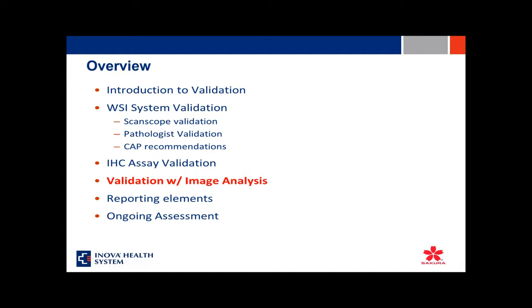And again, there are some other controls also that we need to test every day for these systems. These controls must be tested each day on patient sample testing, and you have to have more than one level. You need to have high, positive, and also intermediate level of controls that we need to test daily. There is also a requirement that these controls be tested by the same person who is testing the patient samples.